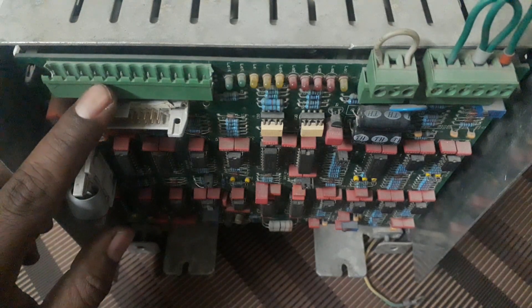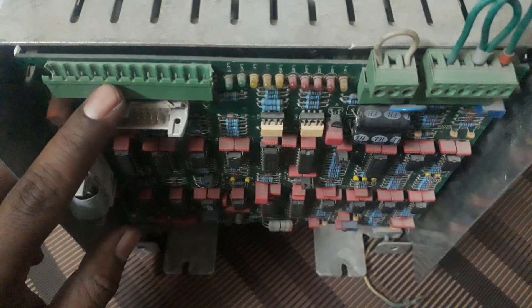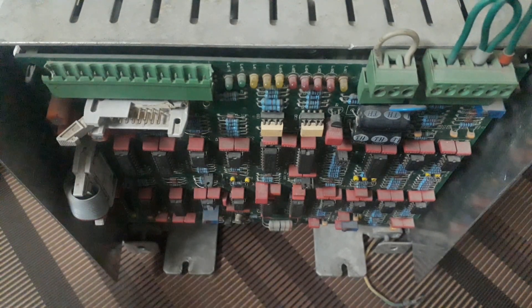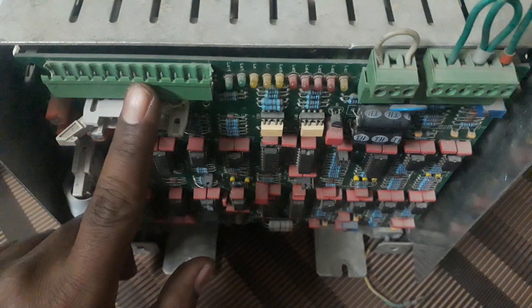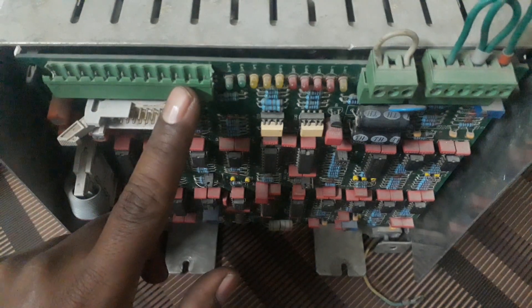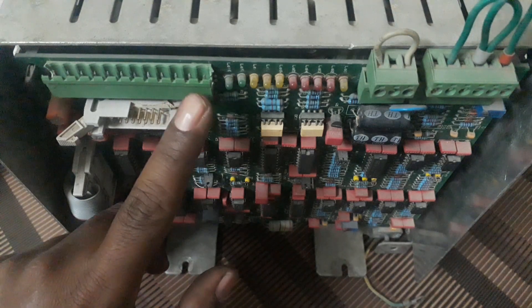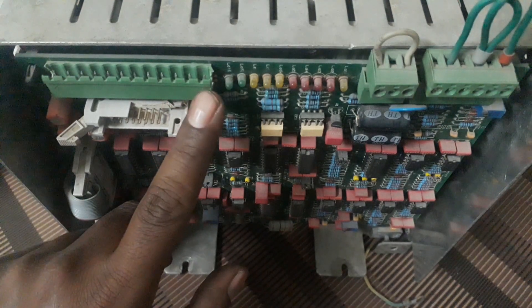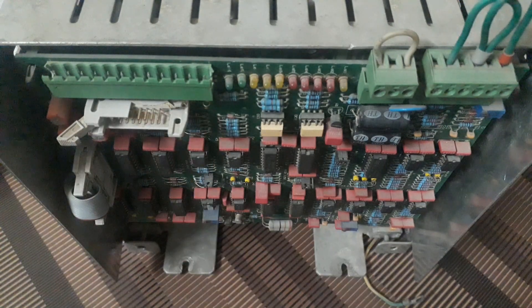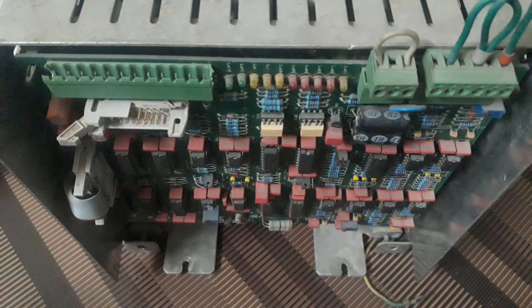Pin number 6 is for the inverter, pin number 7 is for +15V, pin number 8 is for 0V, pin number 9 is for common RX, pin number 10 is for kV reference, pin number 11 is for MA reference (fluoro), and pin number 12 is for MA reference (radiology).